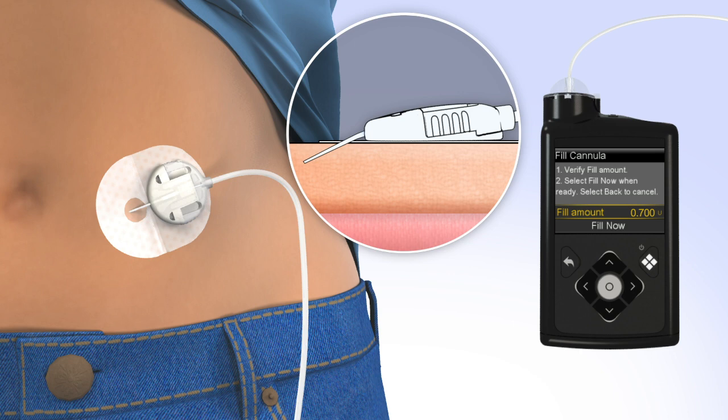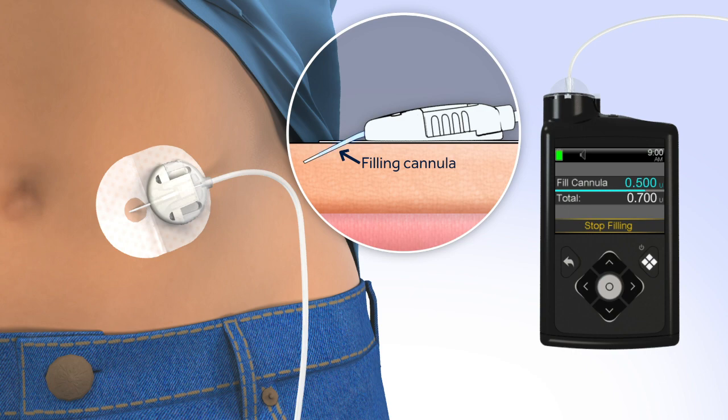If the amount is correct, press down to Fill Now. Press Select. The home screen will display the insulin as it fills the cannula.